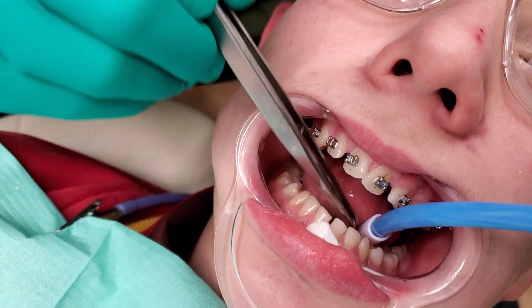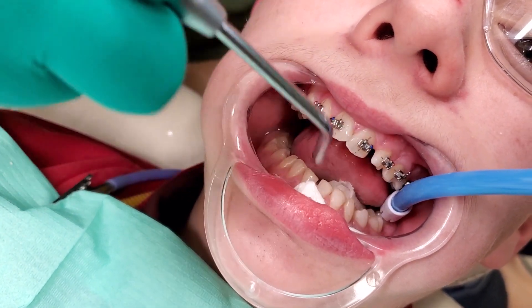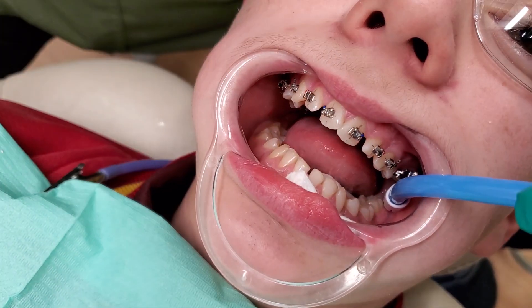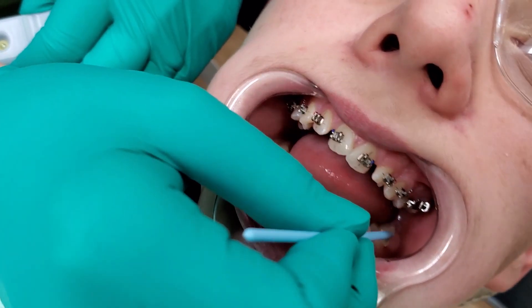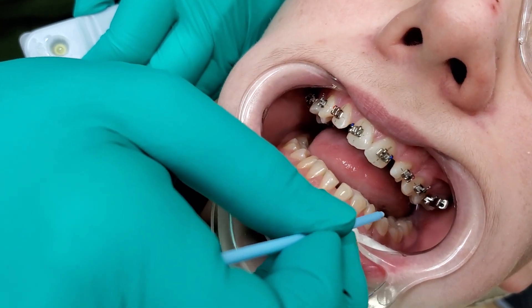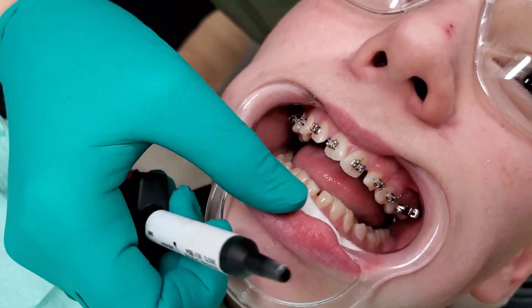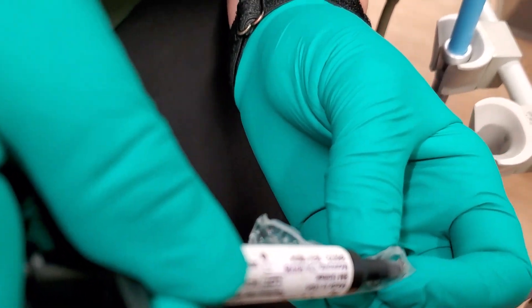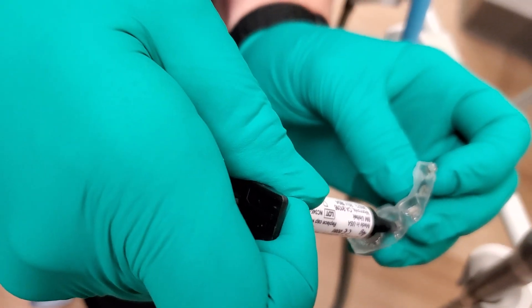This one can kind of give you trouble sometimes holding up your tray as you seat it, so try and get it good and tucked under the tongue there. Don't swallow. Just right where the bracket is going to go — stay open. When loading this, you want minimal but you want to make sure you push it into the bracket. There's a little grid on those brackets and so I try and mesh it into it.